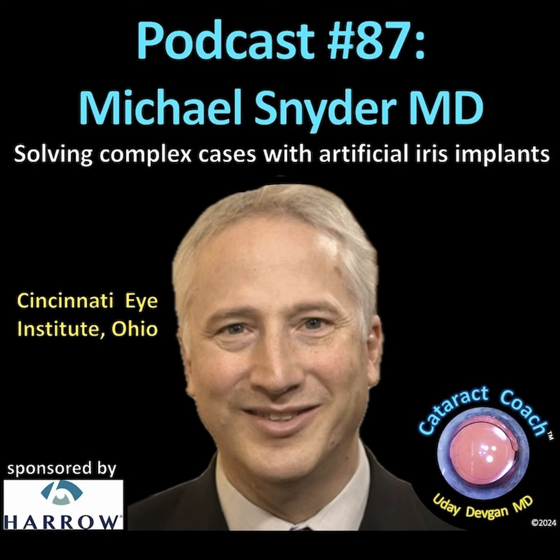So I put the capsular tension rings in, not so much prophylactically for what they might or might not do in changing the incidence, but prophylactically for making my job easier later down the road. And I tell my patients that, I say, I'm putting the ring in because if you have a problem later down the road, it makes my job easier, and it's good for you if my job is easier. Right, it's easier for them too.